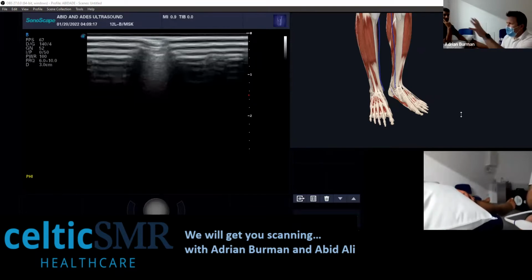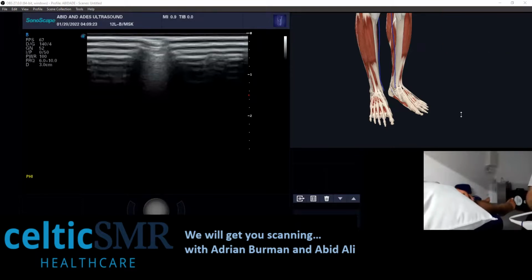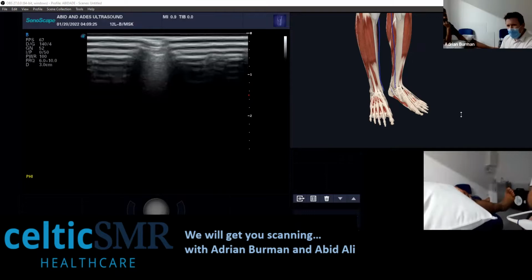Because it's only through manipulating all your settings that you're going to get an idea for what's actually happening on your screen. Sometimes if there's a tear there, you want to maybe interrogate it. So you're going to play around with your settings, alter your probe angles. Perhaps then you're going to increase and decrease your gain as well, just to see if you can carry on identifying it in the same planes. Yeah.